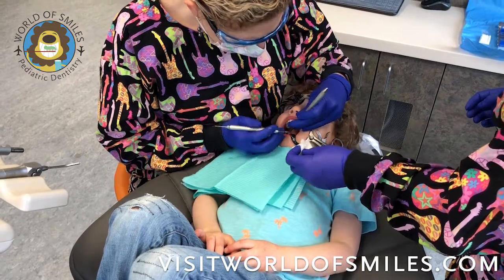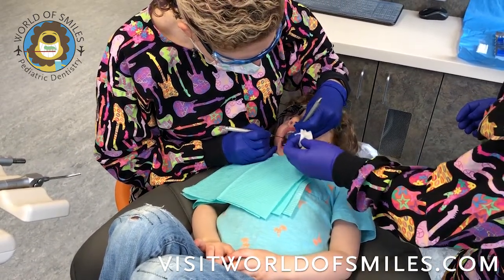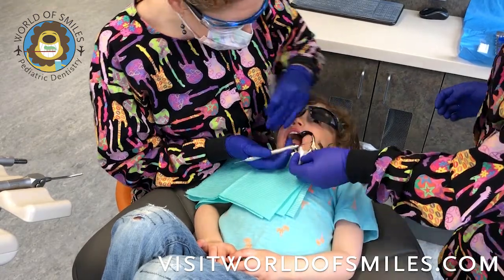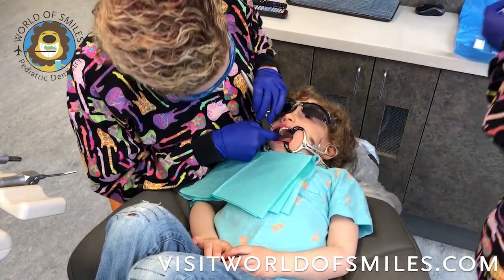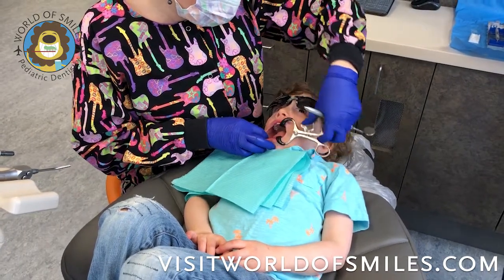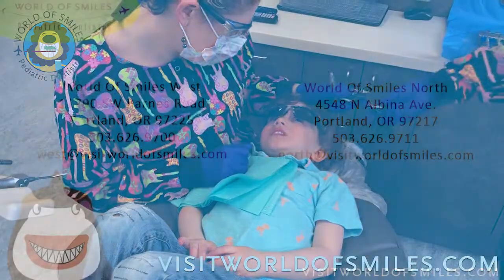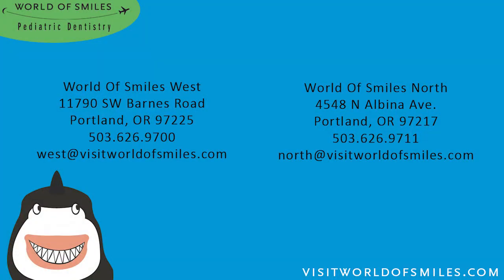Then it's a process of waiting for the glass ionomer to set, because again, we are using a glass ionomer that is not light cured. Once it has mostly set, we'll give the patient a break and just check the occlusion. And that concludes our video on silver diamine fluoride application with the SMART technique.